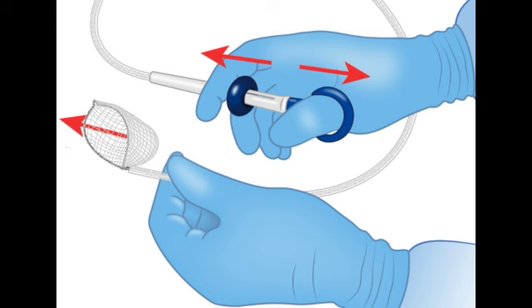Okay, once that's off, the polyp trap gets connected directly to that scope outlet, and the other end of the trap connects back to the main suction canister line. So now, when you apply suction, the polyp gets pulled into the trap's little chamber first. It's safely caught there before the suction continues on to the main waste container. It's actually quite clever filtering. Ah, okay, that makes perfect sense, a little detour chamber.